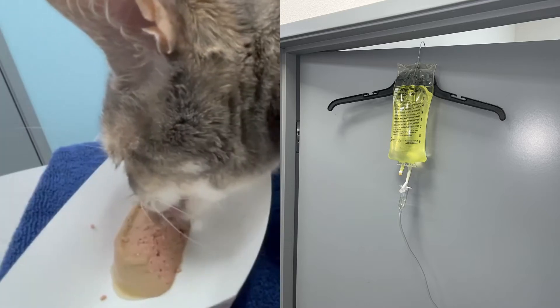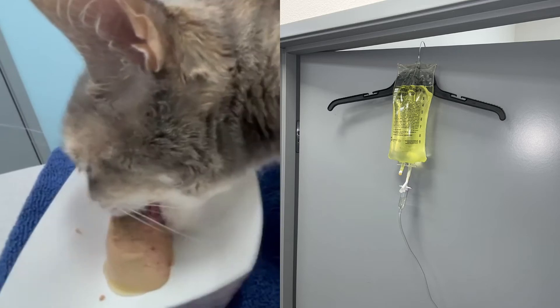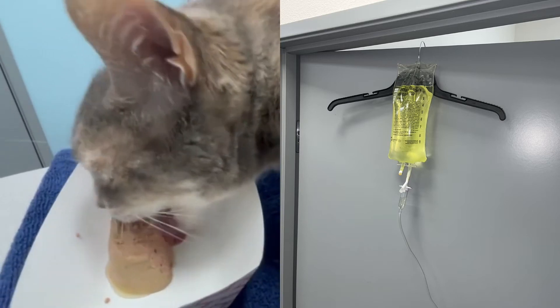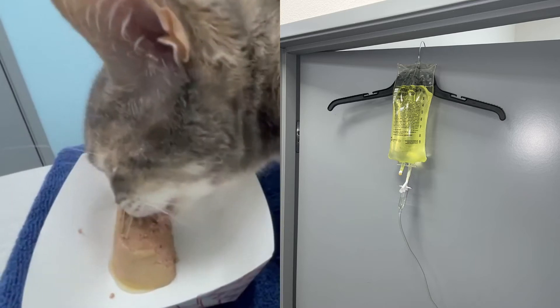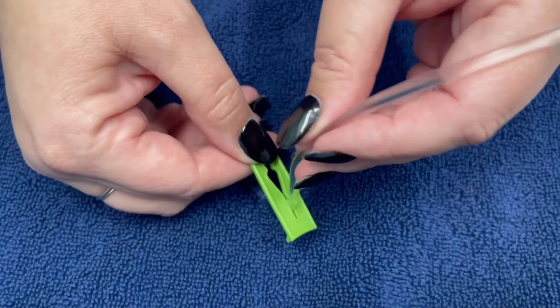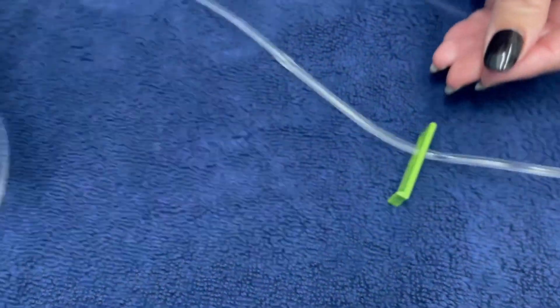For getting your kitty to sit still for the fluids, you can do something like giving them some food so that they're distracted, have someone help you hold them still, or use a towel to wrap them up a little bit so that they're not wandering around while you're trying to give them the fluids.